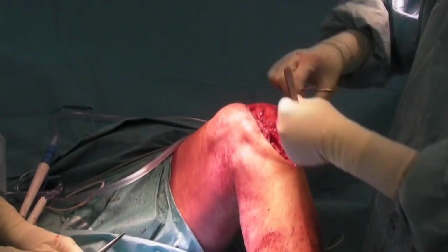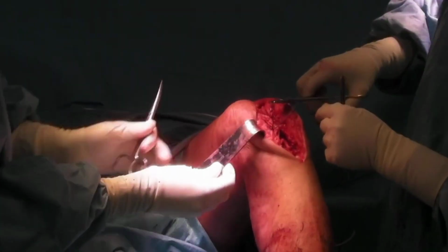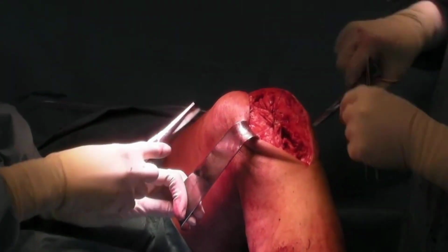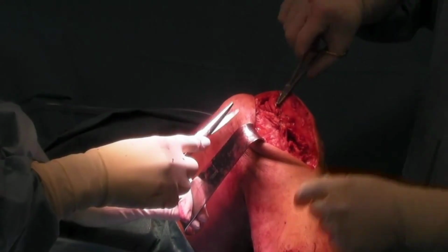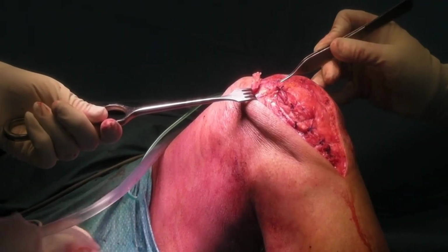After checking once again that the knee is perfectly stable and mobile, we begin to close the joint capsule and the skin using absorbable sutures and metal staples, which will be removed only 2 weeks after surgery.